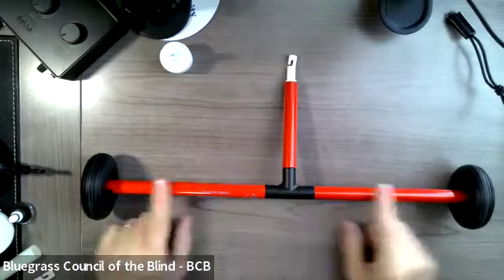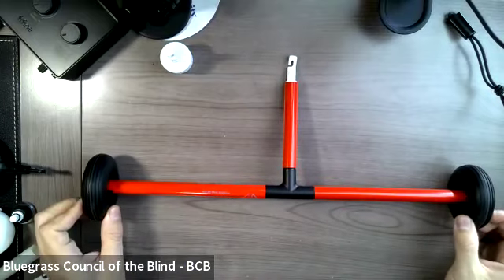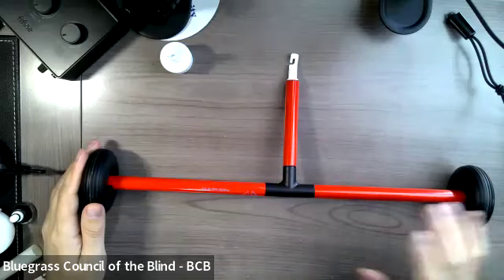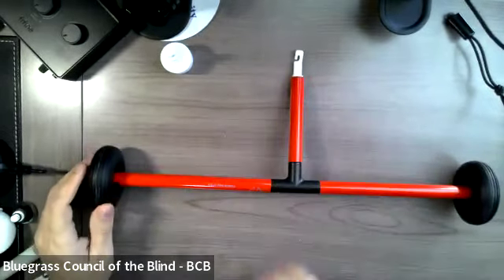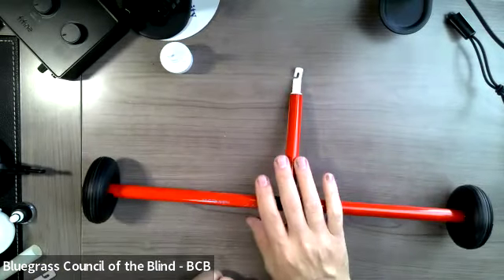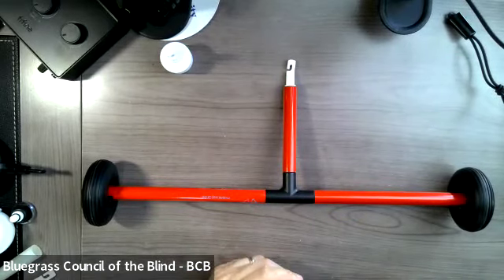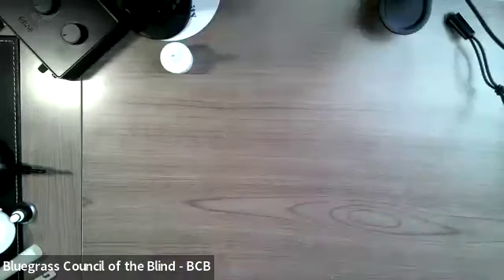Then it looks like a push broom. It's super wide. There's a center axle, and there's two wheels on each end of the axle. And it's the same wheel that's on the rolling wheel tip. So a large diameter black rubber wheel, probably about 4 or 5 inches wide. And you just push it right out in front of you. It's a mobility tool more than it is just a standard tip. So very interesting. Ambutech has several different types of mobility tools. Basically, for people that can't use a standard cane for whatever reason, they have different options that will accommodate that, and this is one of them. Pretty interesting.